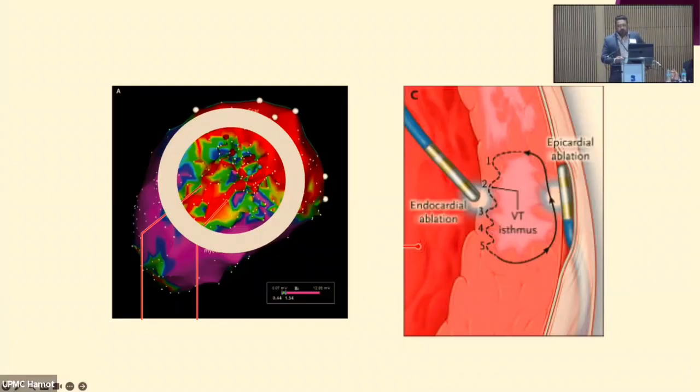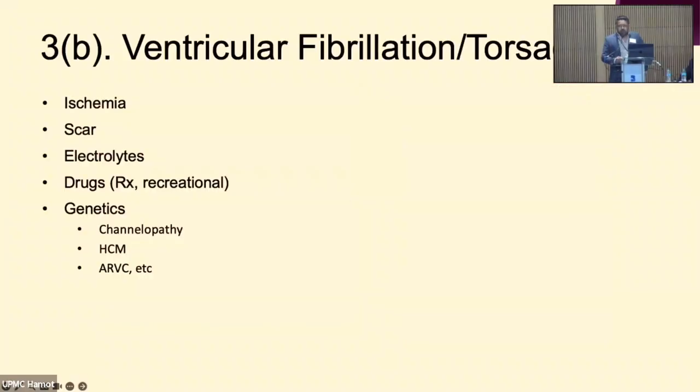That's all scarring. Purple on this map is healthy. Red is dead cardiac tissue. This is the left ventricle, I'm sorry. And the tissue in the circle is all scarring. You put a catheter there. You can imagine how this scar can make electrical wavefronts go just absolutely haywire, and they're causing ventricular tachycardia. You identify the scar, you ablate it.